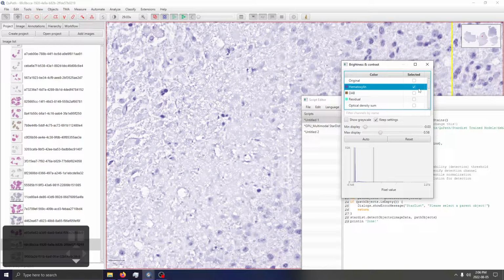What I mean by this is when you do fluorescent microscopy, you have a fluorophore at a specific emission wavelength, and you have filters to capture and filter light such that you're only allowing that specific emission wavelength, or rather a band of emission, to get absorbed by the microscope and consequently imaged. In bright field microscopy, you are capturing visible light, which is a fairly broad range, anywhere from 400 to 700 nanometers. And from this information, you're encoding it into a 3-channel image, which you are then attempting to deconvolute.